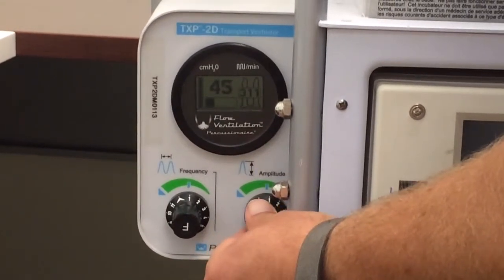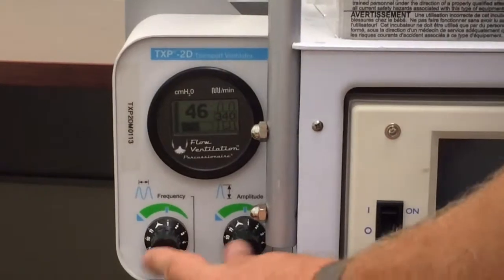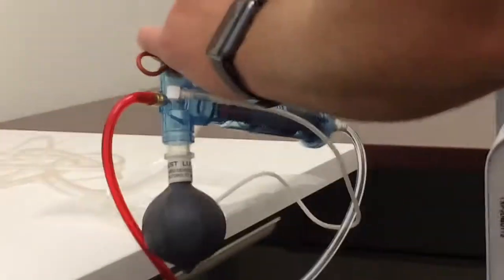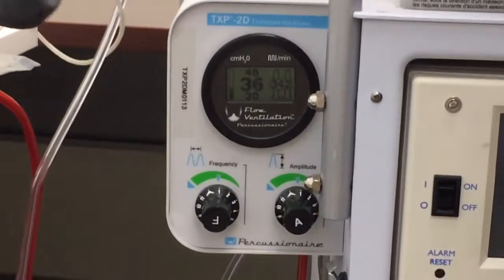We've just put some standard settings on here — amplitude and frequency set at the 12 o'clock position. And then we'll release our mean. This isn't going to be an in-service on the TXP, so hopefully they already know how to use that part.